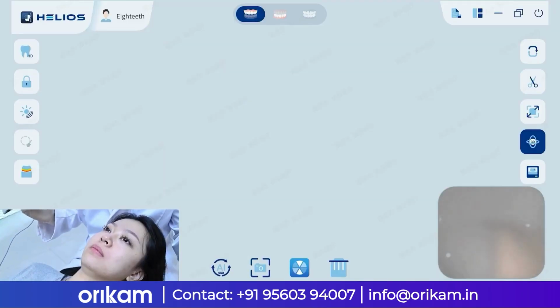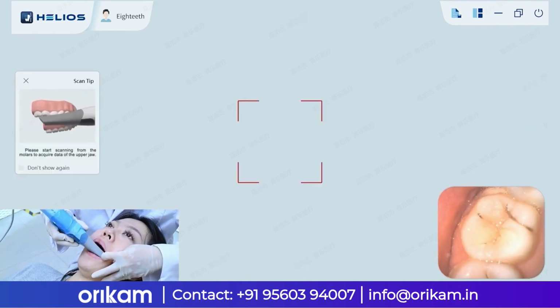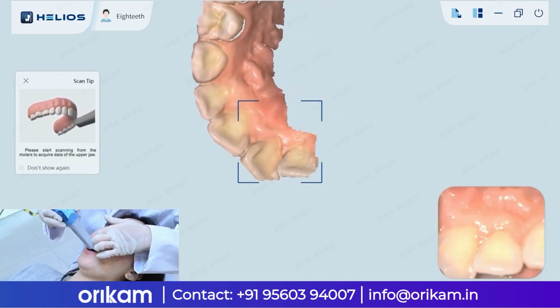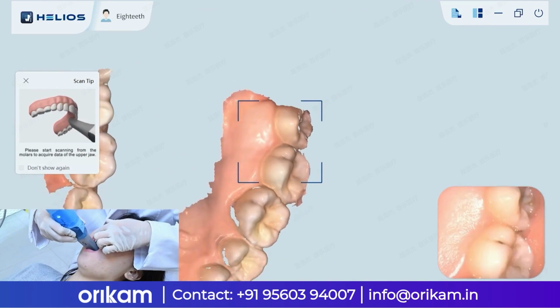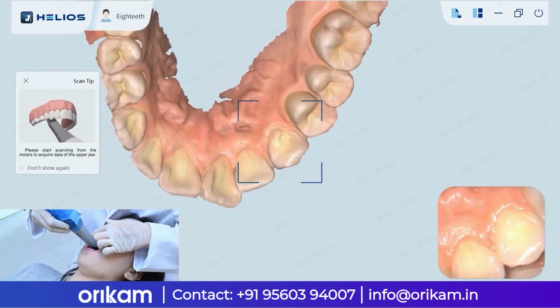When starting the scan, have the patient open their mouth wide and breathe through their nose. Begin scanning from the posterior teeth, moving according to the shape of the arch. Pay attention to the movement distance of the scanner tip. When scanning the posterior section of the teeth, move to the lingual side and continue scanning.